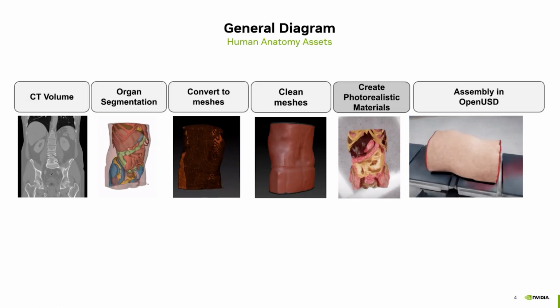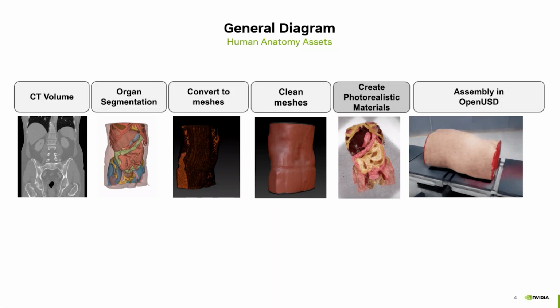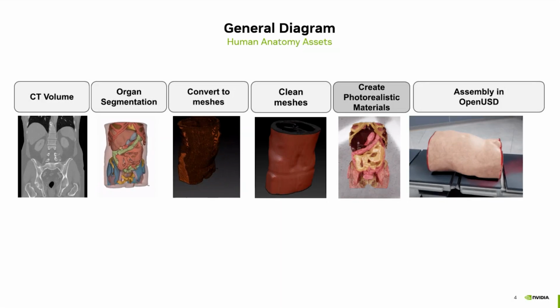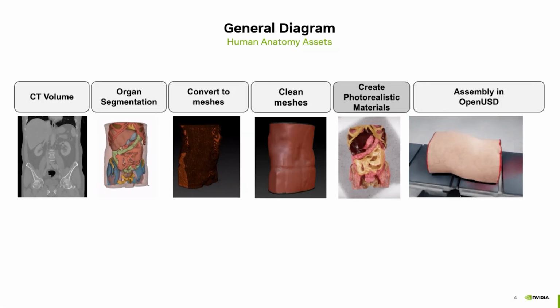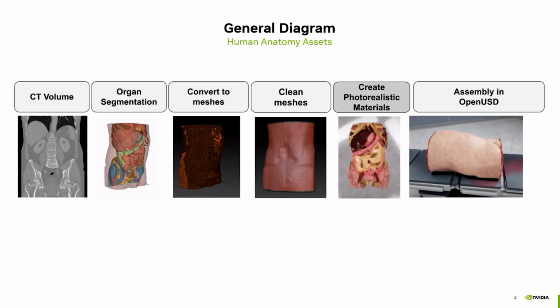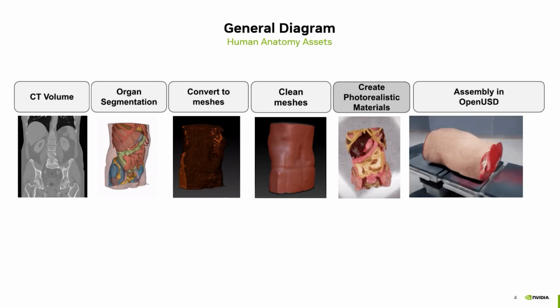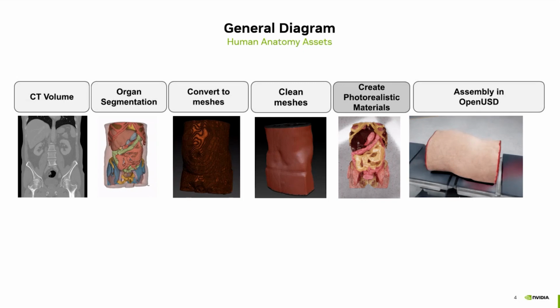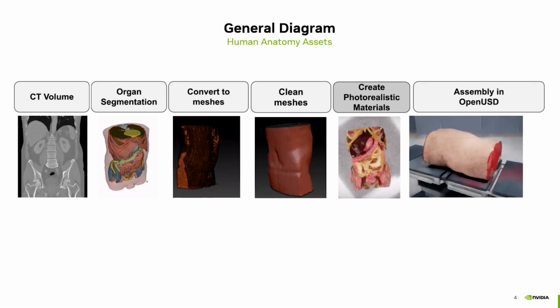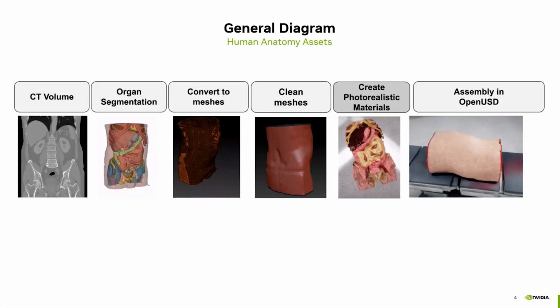Before we move to the next step, we add semantics to the labels. Because we have 100+ regions, we didn't need that amount of detail. For instance, the vertebrae, which number around 24 or 25 depending on the person, we merge into one region called spine. We did the same for the ribs: we didn't need independent ribs, so we merged all the ribs into a single region. The same for the heart and the lungs. Again, this step is to simplify manipulation and analysis of the anatomical structures.